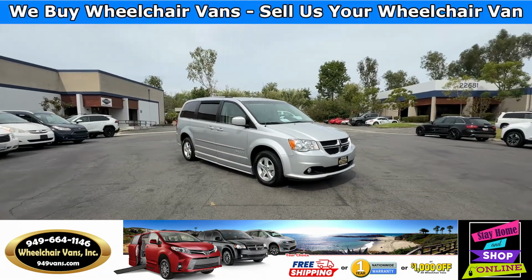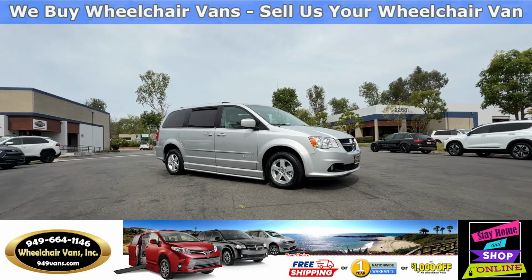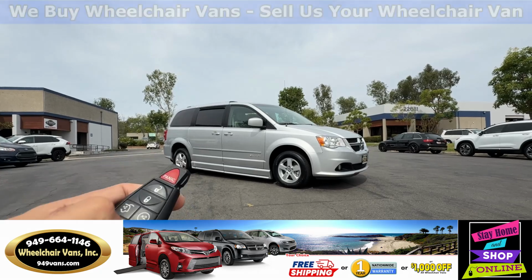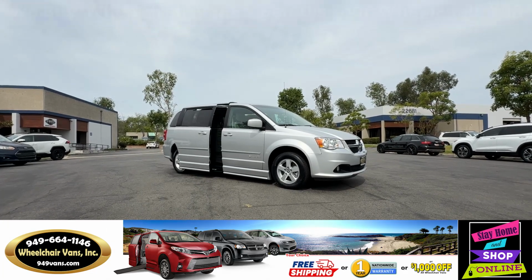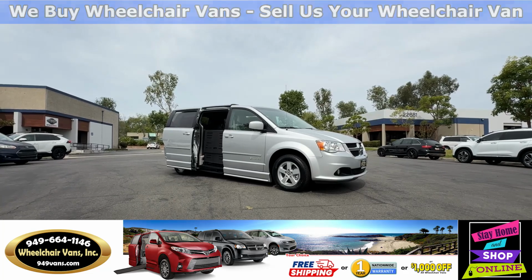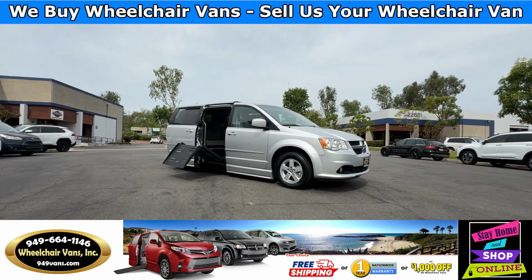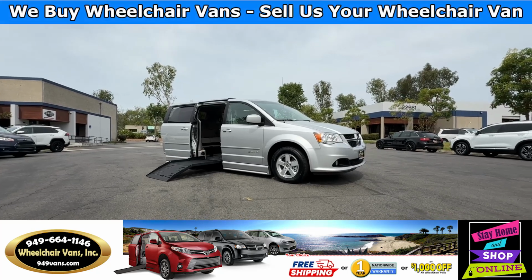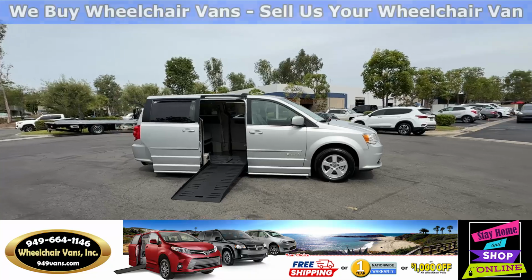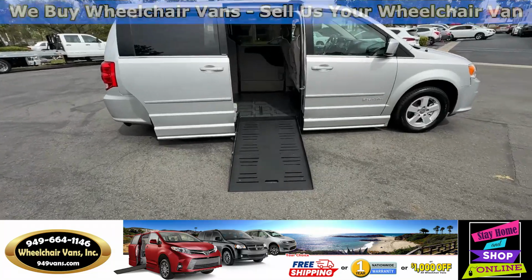Today I'll be going over a 2011 Dodge Grand Caravan equipped with the BraunAbility power fold-out ramp. To operate the ramp, you'll use your key fob to hit the sliding door button here. This is going to open the door, deploy out the ramp, and it will also lower the vehicle. Let's head inside and check out the setup.